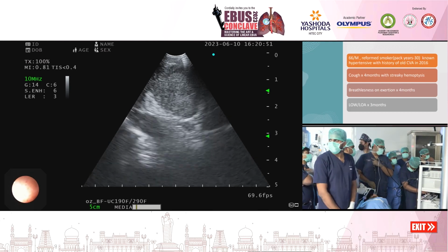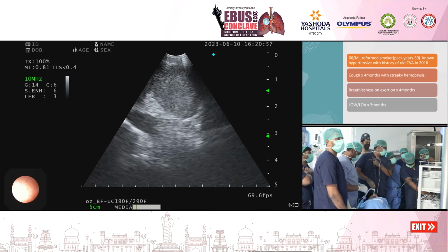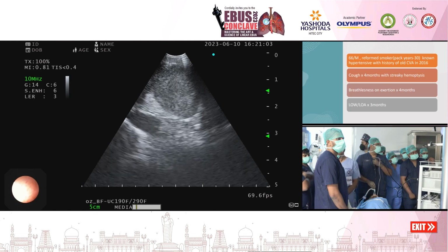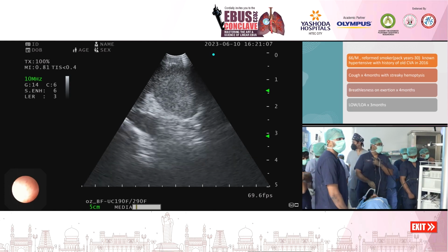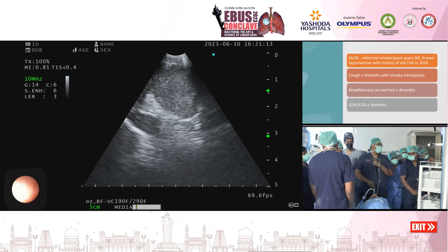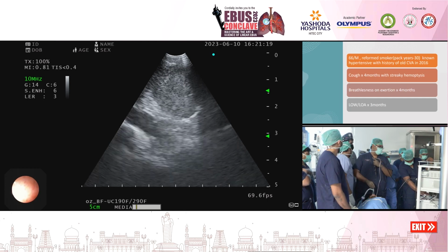So the other thing which you have to understand is conventionally we use what we call as the B mode. B mode is what is used, which Dr. Varun also was talking about. But in B mode also you will have some artifacts. So to decrease the artifacts, you have what we call as the tissue harmonic echo, THE. THE mode has been there in the ME2 also. So now we will show B mode and the THE mode. So this is the B mode. Now we will shift to the THEP.